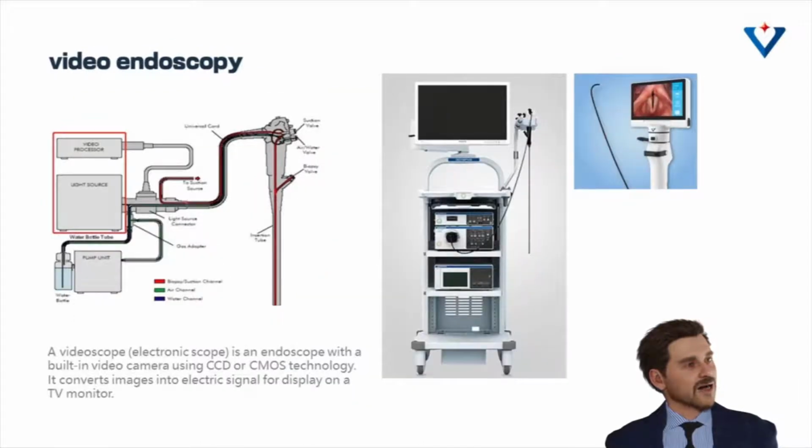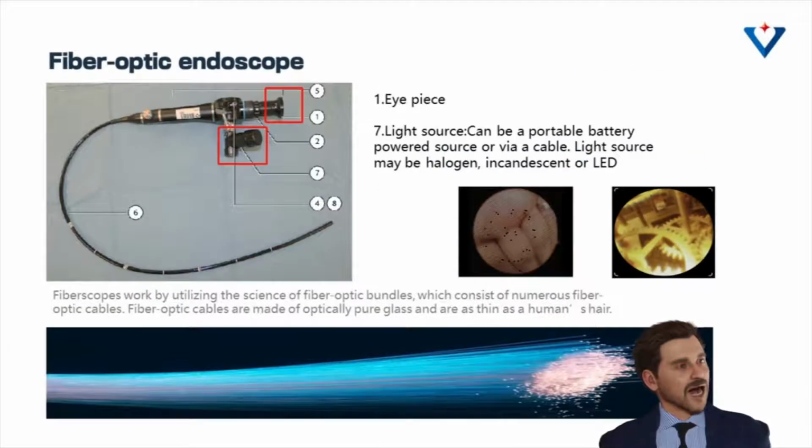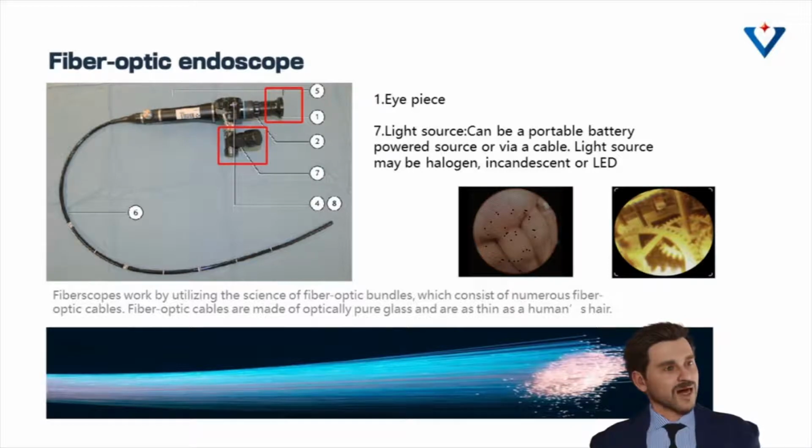And here reminds me of the first time I visited a customer to introduce our product to him. He said, what I'm looking for is a fiber optic bronchoscope. Sometimes, not only dealers think a fiber optic endoscope is better than a video endoscope, even our customers do. That is why we always need to learn and be professional to give them appropriate advice. So, what is a fiber optic bronchoscope? And what is the difference between fiber optic bronchoscope and video/digital bronchoscope, or any endoscope, not just bronchoscope?